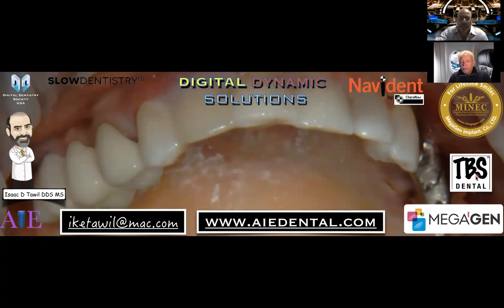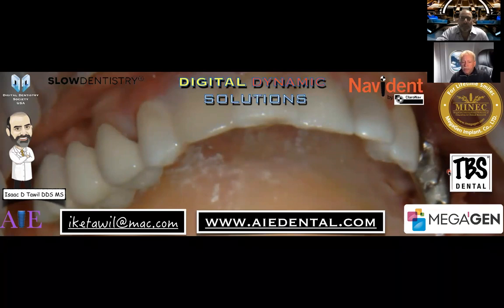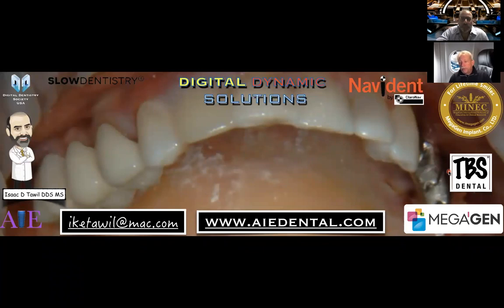Well, the other issue that I want to make sure we impart to the audience is that we don't want people running out there and trying to push the envelope, especially with these transcrestal cases using densiburs. We don't want them trying, on their first case, to raise it 6-8 millimeters. That's just not the way it was designed.